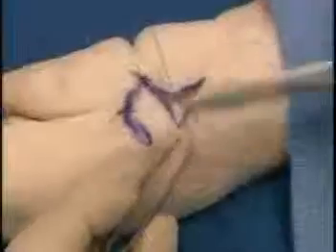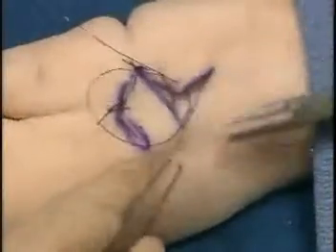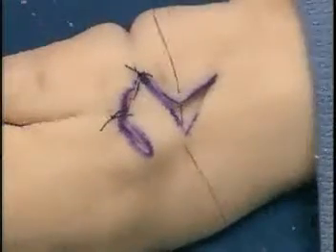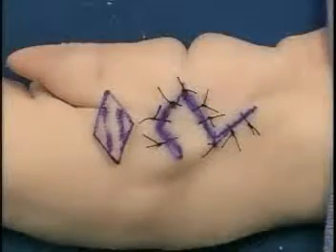Deep sutures, if necessary, certainly can be utilized when indicated after adequate hemostasis is obtained. And once all these corner stitches are put into position, then the wound is closed according to the principles of halving.